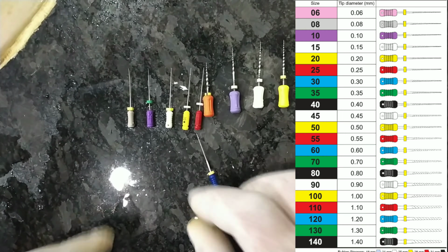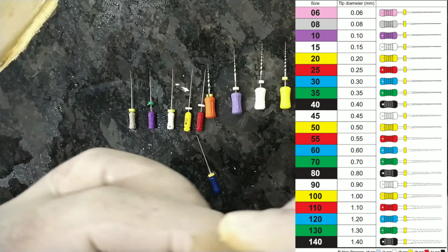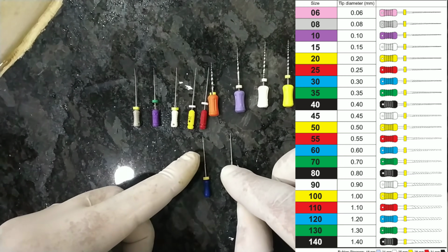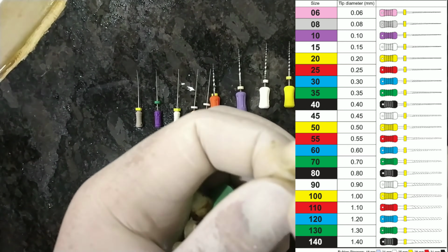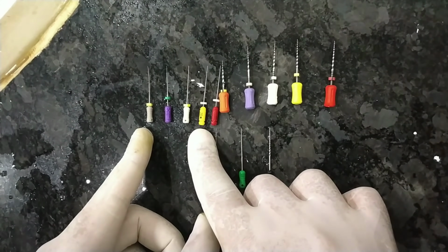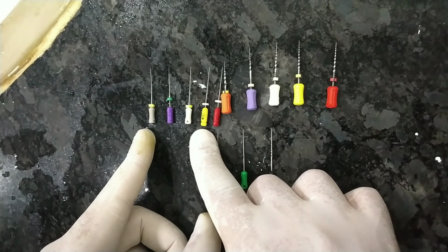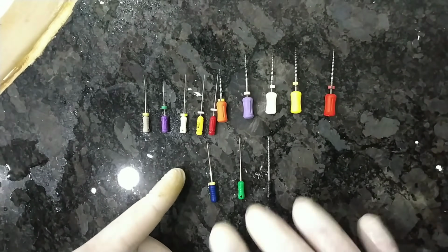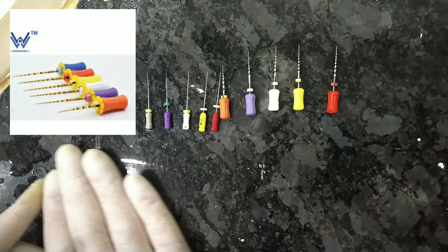So we'll keep it here. Then again it's the green color file which is 35 number. And then again is the number 40 file. So till 20 we have to compulsorily use for getting the straight line access. If the canal is curved, you have to use till number 25 red file. Okay, we'll keep it aside.